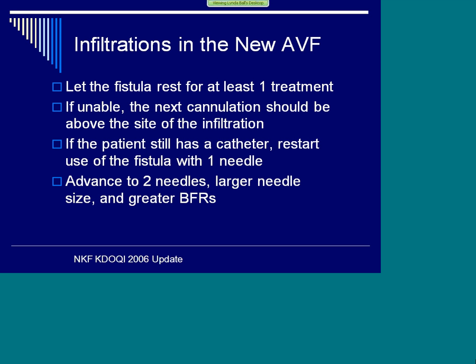Then in 2006, they updated the guidelines. And it said, let the fistula rest for at least one treatment. And if unable, the next cannulation should be above the site of infiltration. Well, I'm sure that you always look above the site for that anyways.